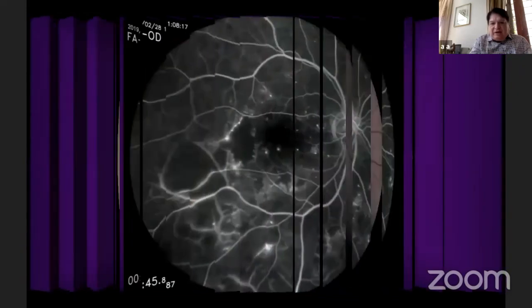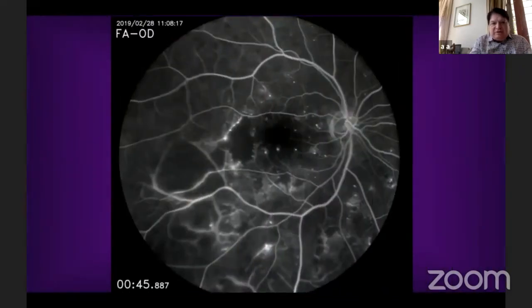Now, this is the picture which I saw first, which gave me enough idea that yes, there are dropouts. There are areas which require heavy lasers, and there are areas which require treatment. But again, I found that there is a difference between the two. The upper retina was seemingly better, though there were lesions, but they are better than the lower retina. And then the video angiography gave me a clue as to why it is happening.